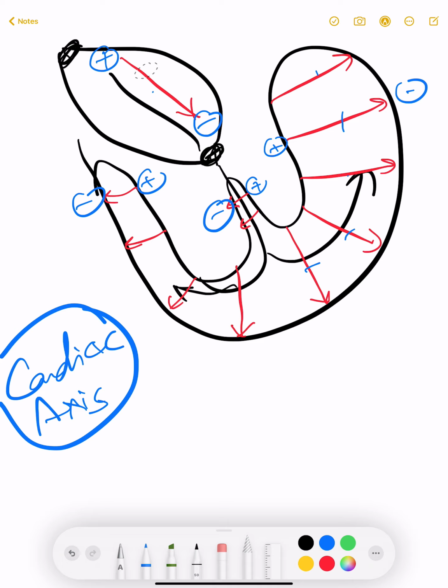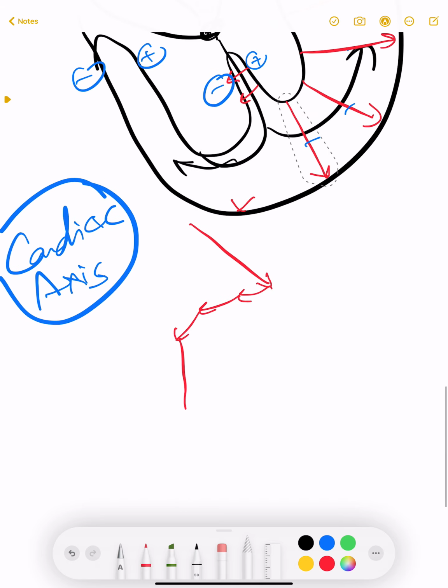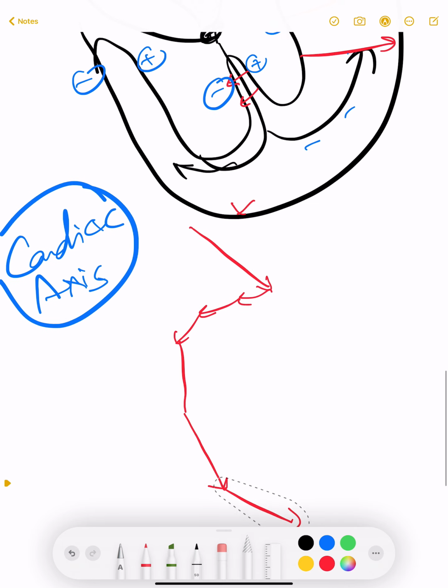I will take all of these vectors one by one. This was our first vector. I will add the second, putting the tail of the second one on the head of the previous one, and I will do this for all of them. Okay, bear with me.